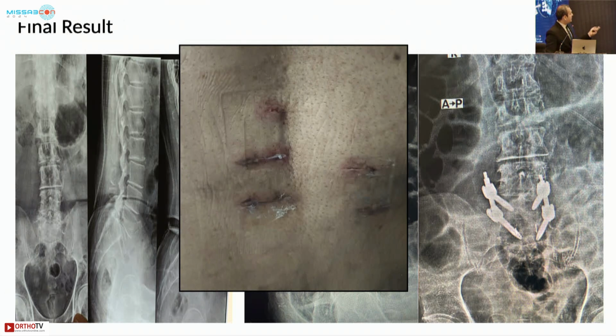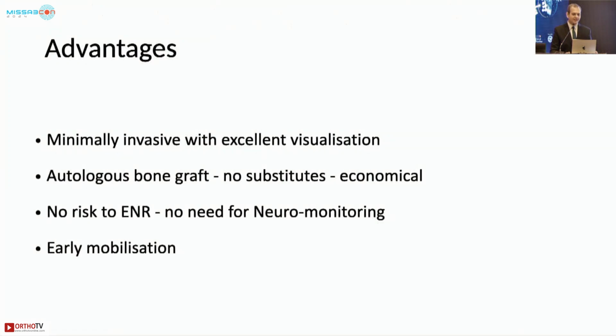So we started with the L3-4 level, so that's the scopic portal for L3, L4 level. Then we moved down, L4-5 was done through the same incision, and because of the difference in the angulation of L4-5 and L5-S1, the same portals for L4-5 were used for L5-S1 facetectomy, and after facetectomy and cage insertion, we increased the length of the incisions for inserting the percutaneous pedicle screws. So 5 incisions for the complete procedure, no extra bone graft or anything needed.